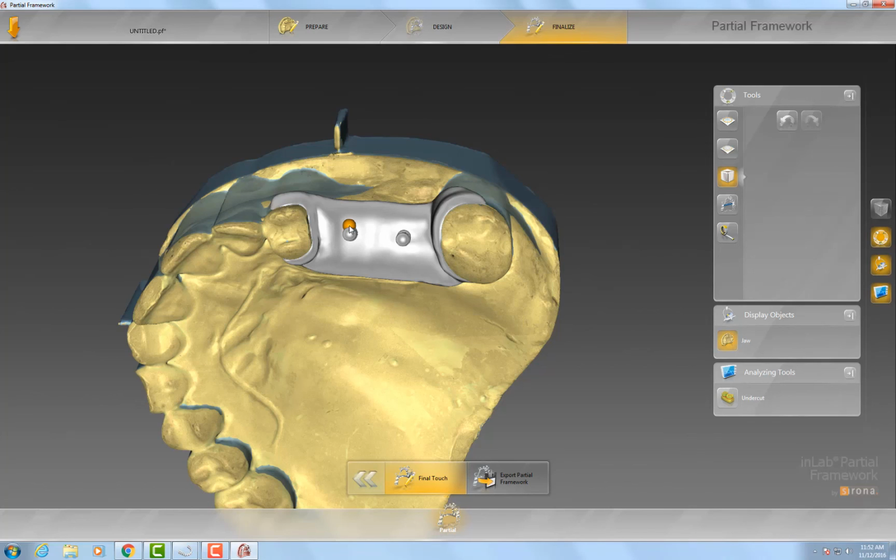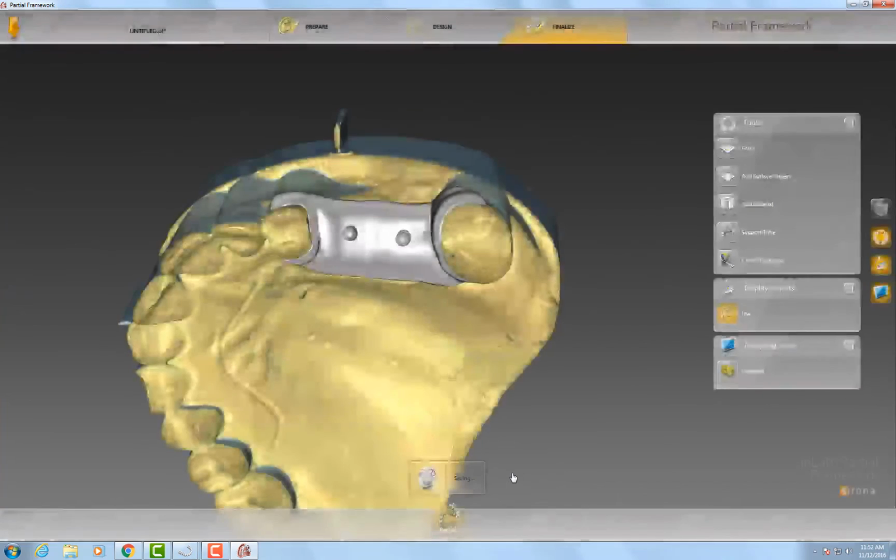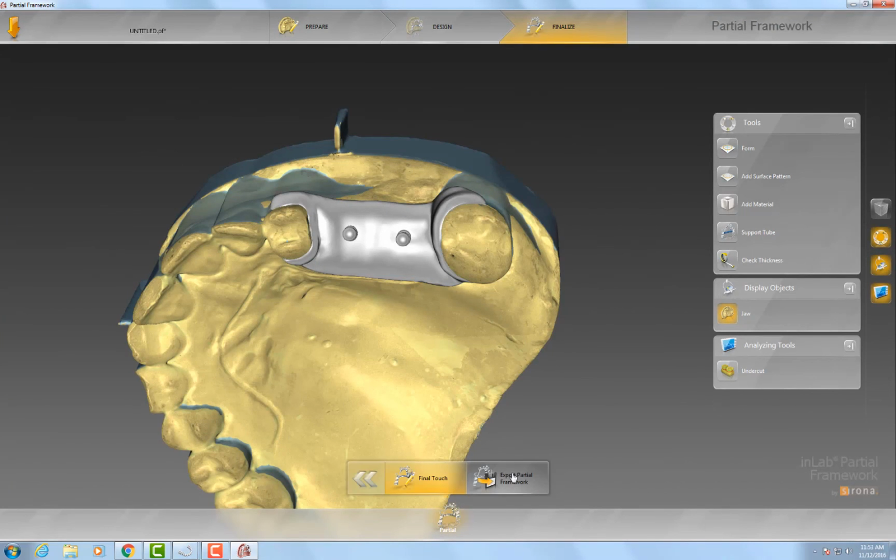That's what I really like about this software: over the past, I'd say about 6 months, when we really started getting efficient with it, we've cut our labor rate by over 42%. We've cut our material rate, I believe, by 10%, and we've actually adapted into new technologies that are causing doctors to buzz B&R Dental Lab as the word.